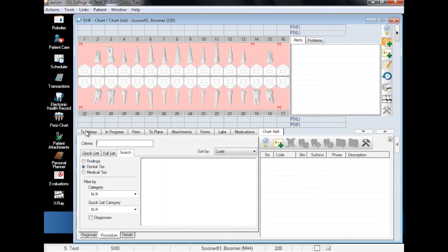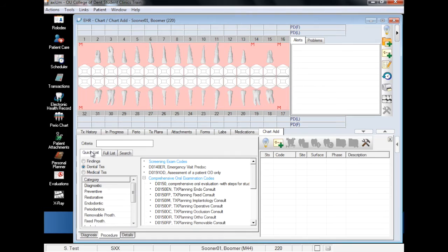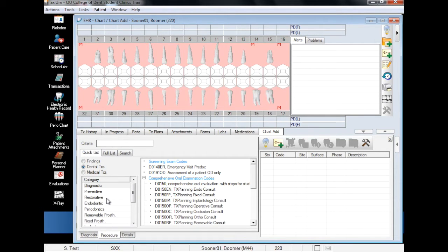Since we are adding common restorations today, we will work out of the Quick List. We'll start by adding Amalgam Fillings. Be sure the Dental Treatments radio button is selected under the Quick List tab and choose Restorative from the Category list.